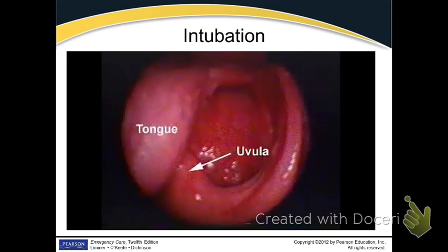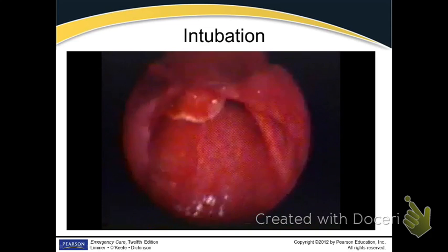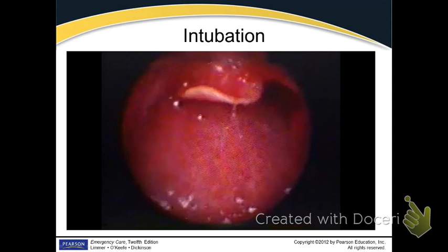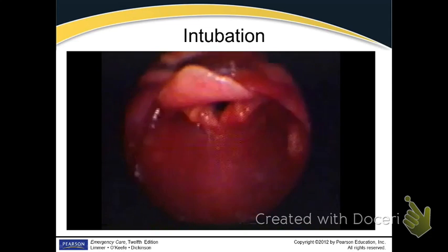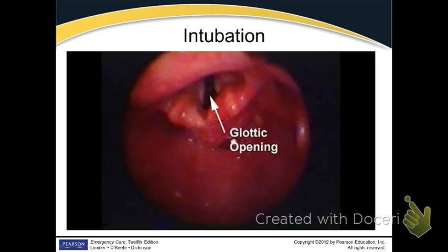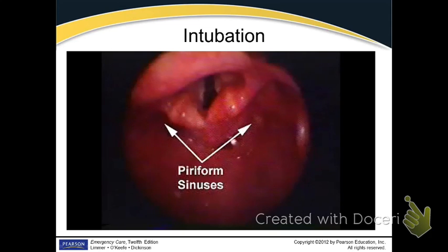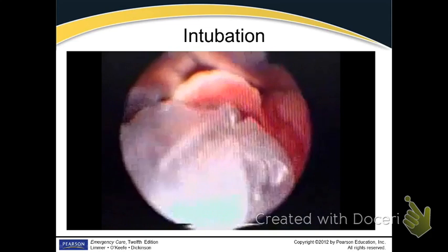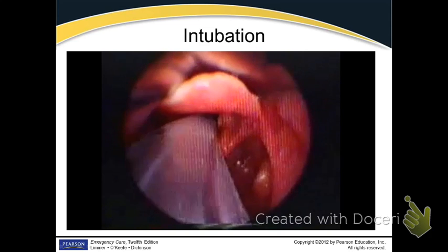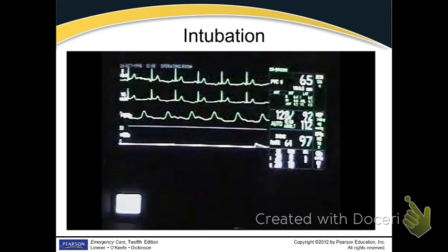Advance the laryngoscope blade down the midline until the epiglottis is visualized. For a curved blade, slide the tip of the blade above the epiglottis until it stops in the vallecula. For a straight blade, the tip of the blade lifts the epiglottis. Pull the laryngoscope in the direction of the handle to expose the glottic opening. Do not rock the blade against the teeth. Advance the tube from the right side of the mouth, keeping the glottic opening in view. Tip the tube up and in, advancing until the cuff just disappears beyond the vocal cords. Placement of the tube in the trachea must be confirmed, preferably with detection of carbon dioxide.